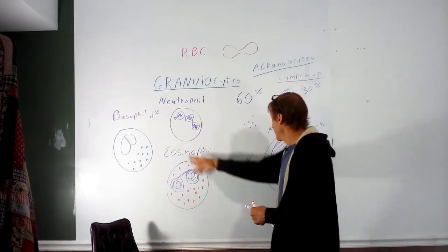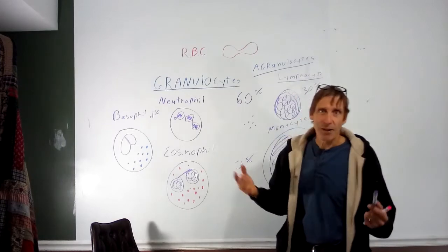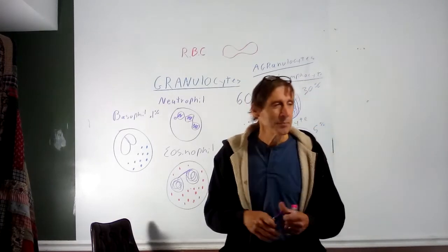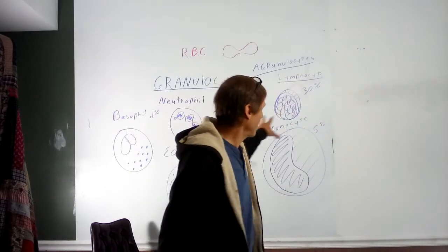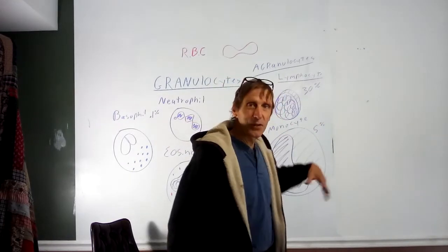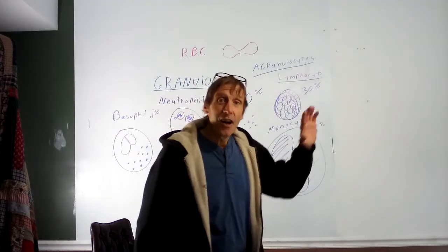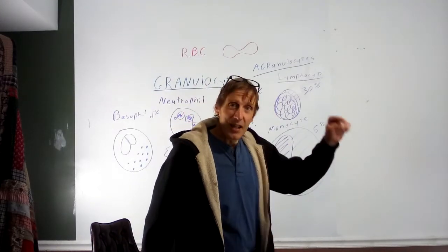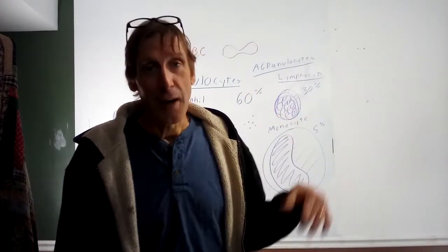That's it. So you got 5 white blood cells, the platelets, red blood cells. You identify those. That's going to be part of the lab exam. Be able to list me the functions somewhere. I might ask them in the lecture or lab. I'm not sure yet. But just a brief function and the relative frequency or occurrence of these things, you'll be good. Now, what I'll tack on at the end, I'll go through the PowerPoint I've posted to look at actual micrographs so you can see what they really look like, not these ugly stick pictures. I'll be back.